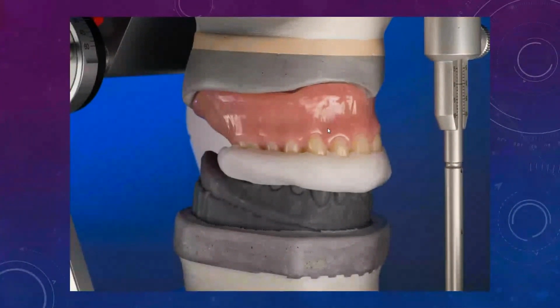And then, if the patient is semi-conscious, you can have them bite down in the regular bite. But oftentimes I like to have some kind of splint pre-made so I can guide them into the occlusion a little bit better. But oftentimes with these immediate conversions, guys, the bite's still not going to be the best, and it will need to be adjusted.